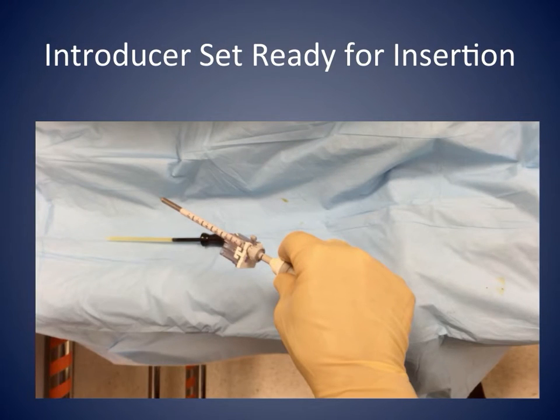Notice how the depth stop fits into the needle guide and locks to it. Also, notice that the stylet protrudes a little bit greater than 2 centimeters beyond the plastic introducer to create a path for the biopsy device. Notice also the step at the junction of the plastic introducer and stylet. This can be a point of resistance while inserting the system through the skin, in particular if the dermatotomy is small. So it is useful to keep the needle holder close to the proximal end of the introducer to visualize the coaxial system in its entirety while it's advanced through the skin incision.